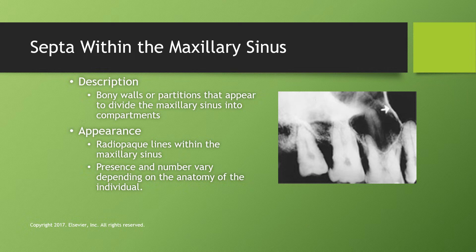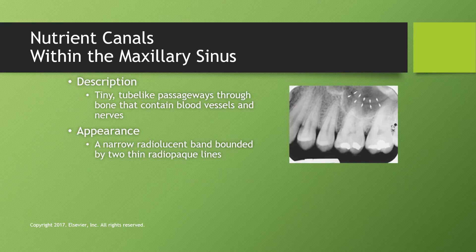Septa within the maxillary sinus are bony walls or partitions that appear to divide the sinus into compartments. They appear as radiopaque lines within the maxillary sinus, and their presence and number vary by individual. Septa is also the plural form of septum. Nutrient canals are tiny tube-like passageways through the maxillary sinus, supplying blood, tissue, and nerve to the teeth. They appear as a narrow radiolucent band bounded by two thin radiopaque lines representing the cortical bone walls.